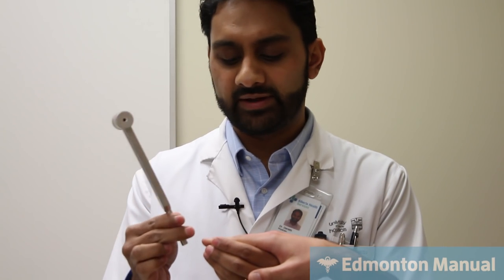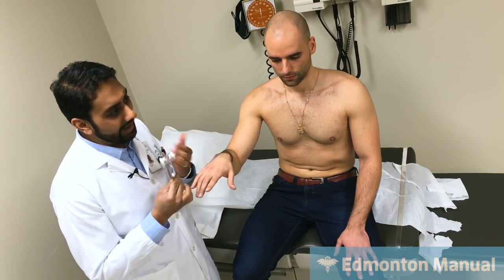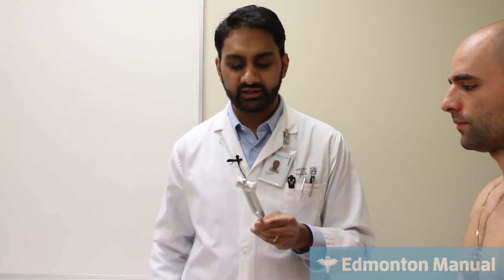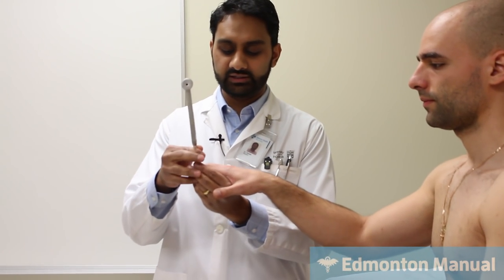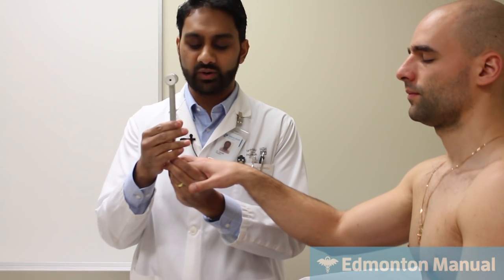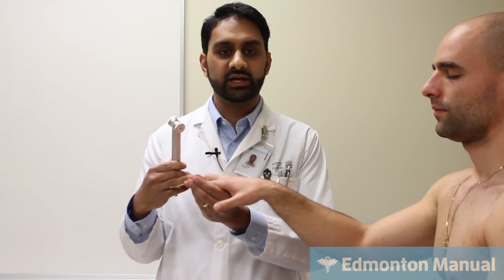Some people will test the vibration by waiting and seeing how long it takes for them to stop. I don't find that's as useful because I can't reproducibly hit the tuning fork the same every single time. So it could vibrate for different lengths of time. So what I find tends to work better, again, please give me your hand, support that on there, is just doing that. Close your eyes please and tell me when it stops. Now. Okay, and you can see that his sensation was quite good. You would repeat that a few times just to make sure it was quite accurate.